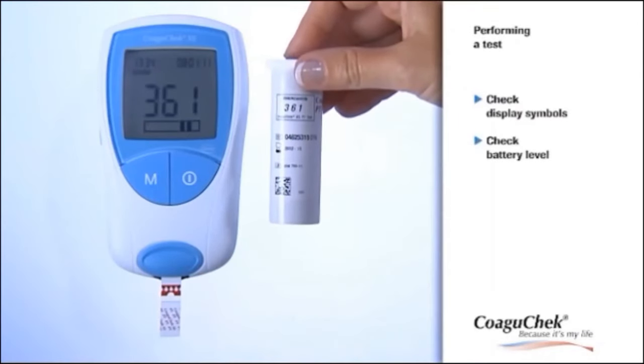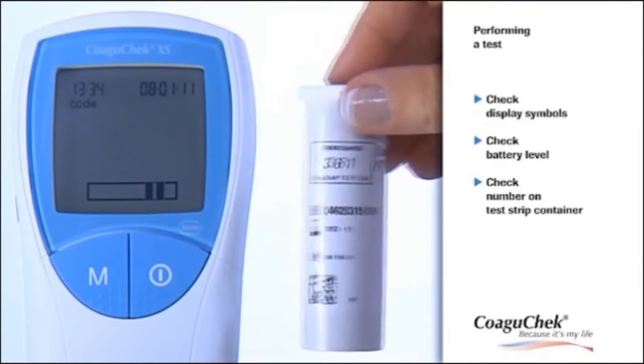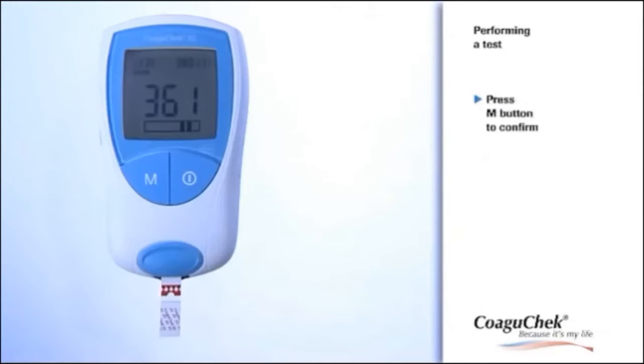The code number of the code chip inserted is displayed. Make sure that this number is identical to the code number printed on the test strip container. Please press the M button to confirm that these two numbers are identical. Using the wrong code chip can produce inaccurate results.